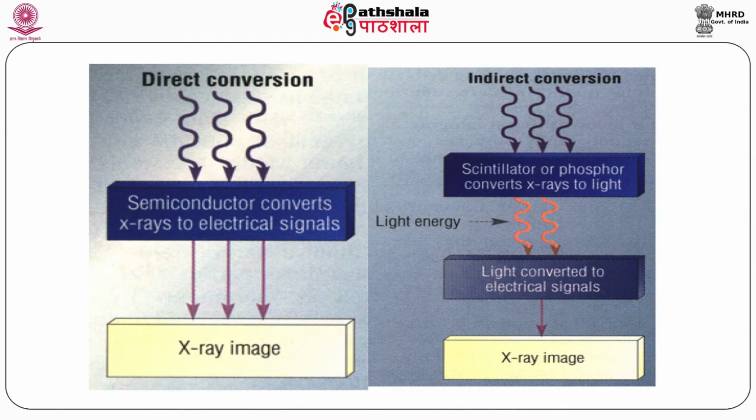Now, there are two types of light. One is the light emitted by the laser beam, another one is the visible light produced by scanning the laser beam. So, there is a filter which filters out the laser beam and allows the visible light emitted by the exciting phosphor plate.